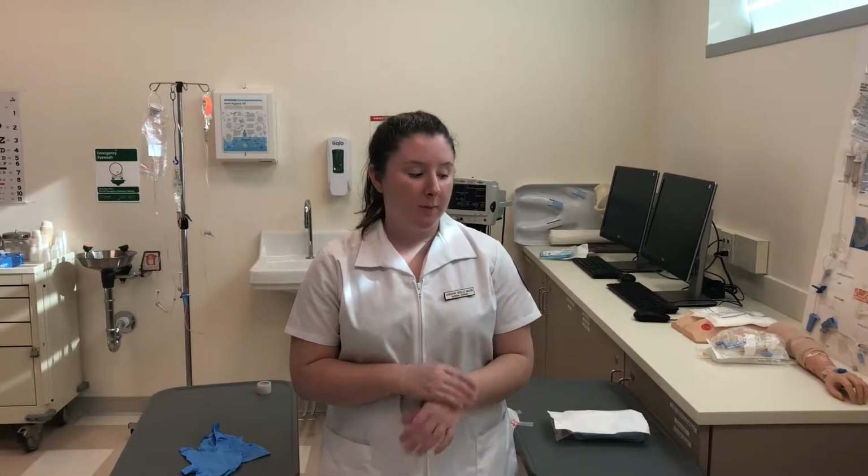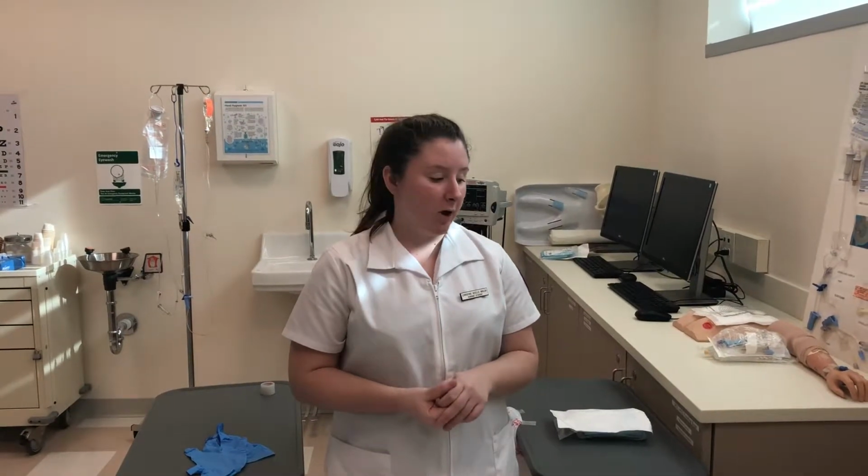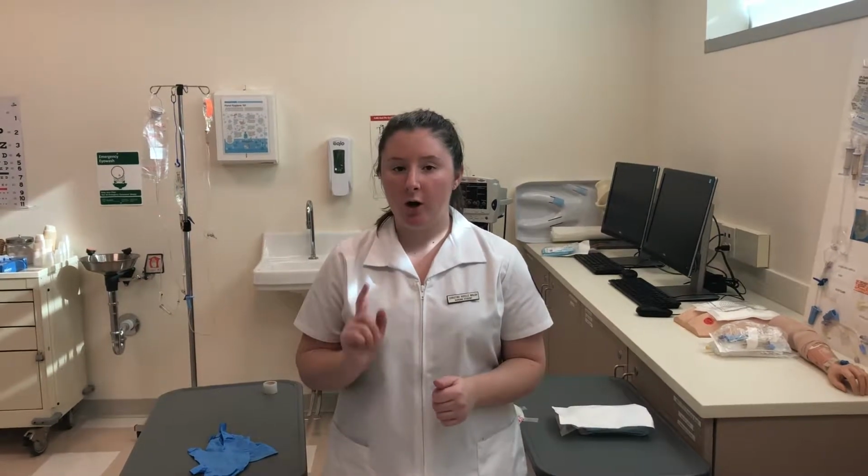So the first thing I'm going to do is do my 7 steps, which is to check the doctor's orders, identify the patient by looking at their wristband, explain the procedure, introduce myself, gather all of my equipment, wash my hands, and provide for patient privacy by pulling the curtain around.